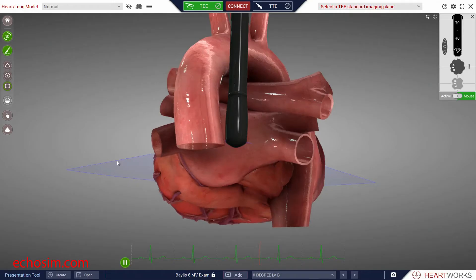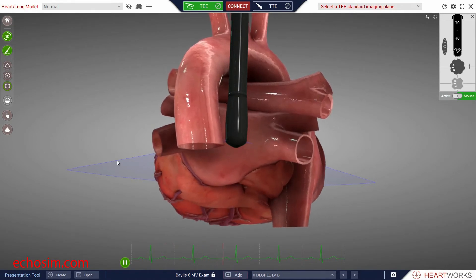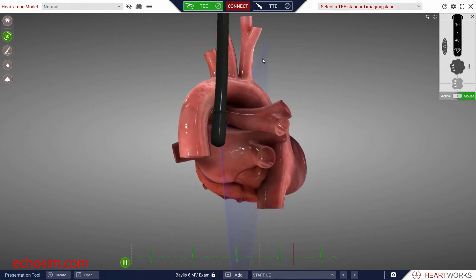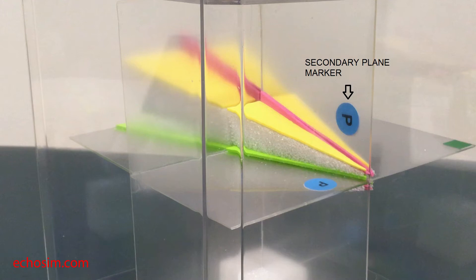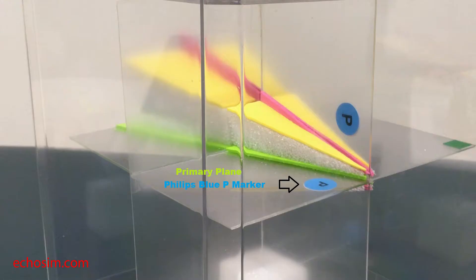With either 3D TEE or TTE, probe rotation is performed automatically in any of the 3D modes, including X-plane. The clockwise rotation is a virtual rotation automatically performed by the machine in concert with the 3D probe. The secondary plane also has a marker. On both the TEE and TTE probe, this is a virtual or imagined marker, located in an imaginary position where it would come to lie if the primary plane and marker were rotated 90 degrees clockwise. Here we see the preserved relationship of the blue P marker as the green plane is effectively rotated 90 degrees clockwise to create the pink plane.